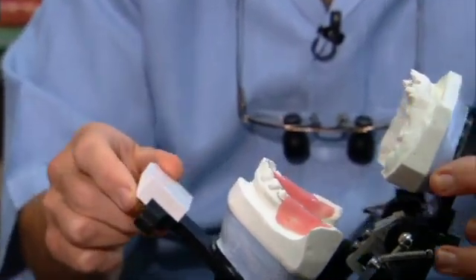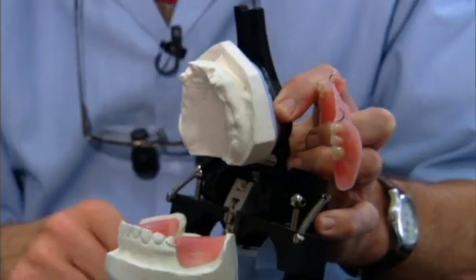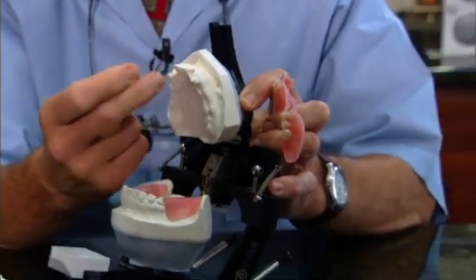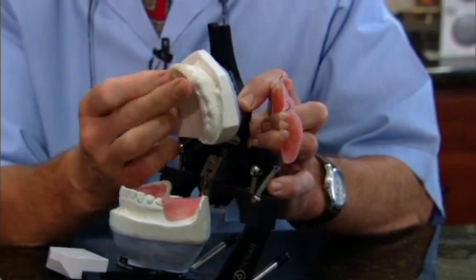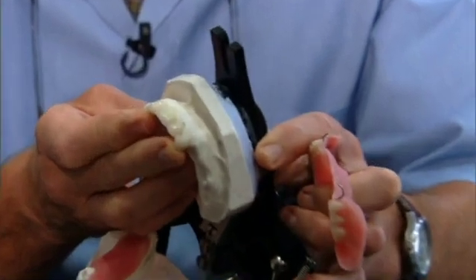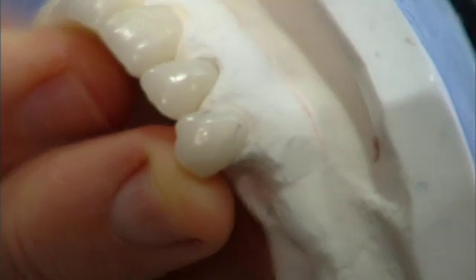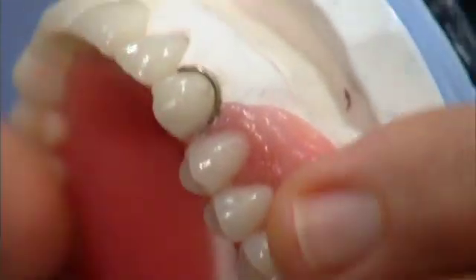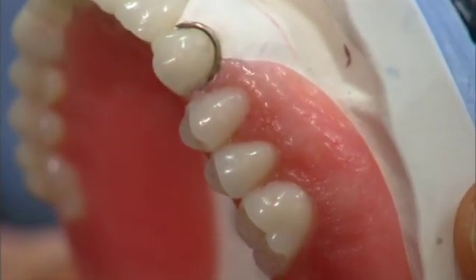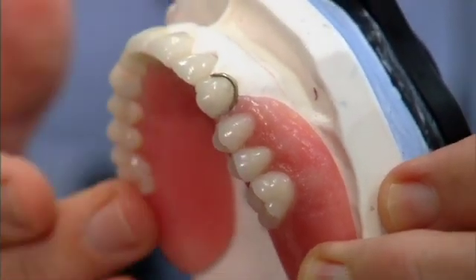And as you can see, the laboratory has prepared the teeth, and they've given me a guide as to where my pontics need to go and how deep they need to go into the sockets so that we can create excellent emergence profile from the tissue and support the hard and soft tissue with our pontics while Beverly heals. Our temporary partial fits to that existing provisional like that. And so when she leaves today, she'll have provisional bridge, temporary partial.